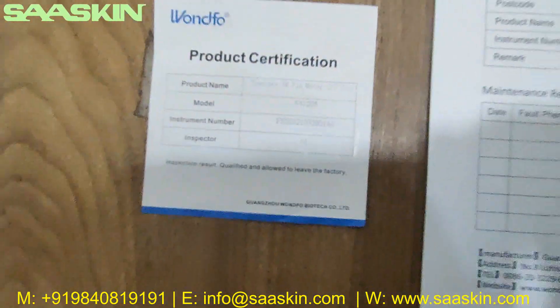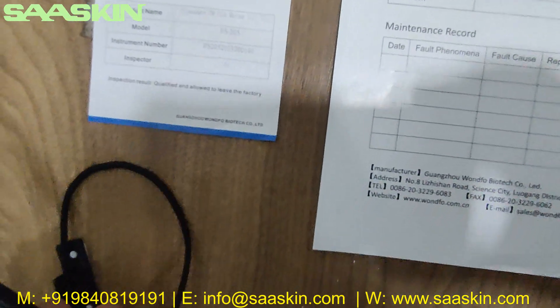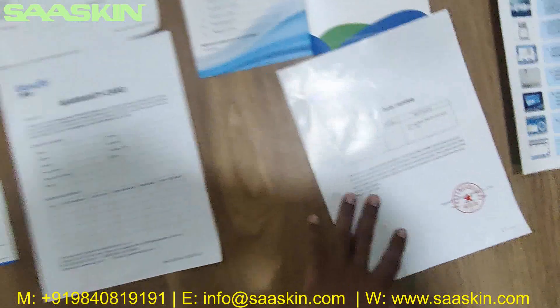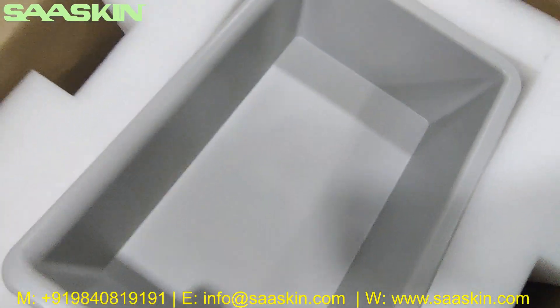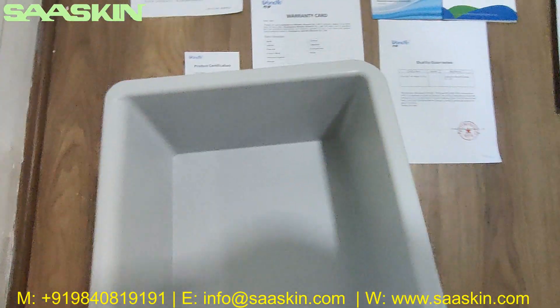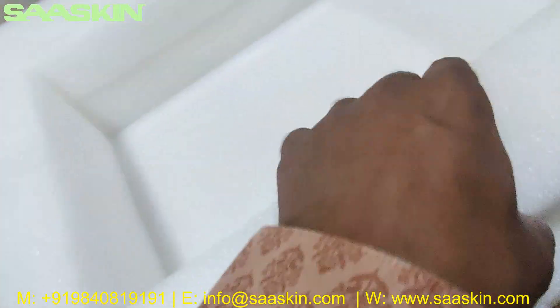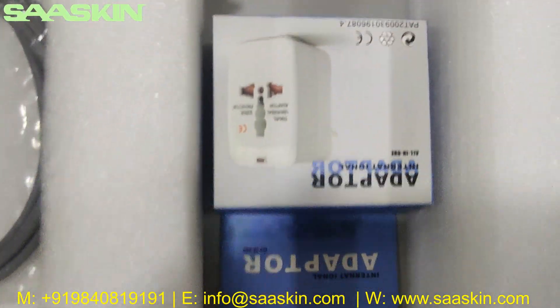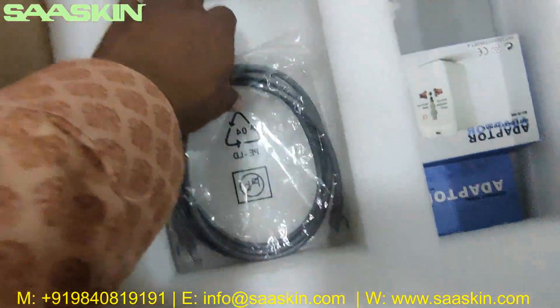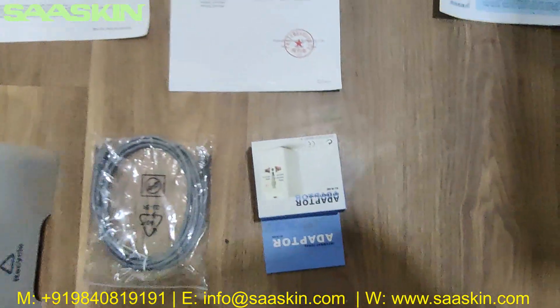There is a tray here — I'm going to keep the tray aside. Moving further inside the box, you can see there is a power cable, an adapter, and a network cable. Let me take them out to show you everything. So you have one network cable, one adapter, and one power cable.